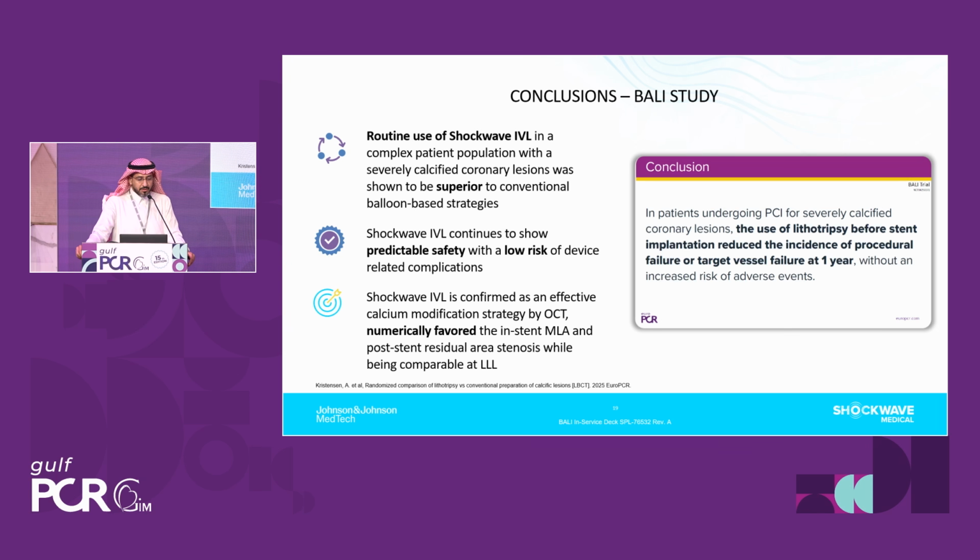So in conclusion, by this trial, we can declare a positive finding that the complex patient population with severe calcified coronary lesions was shown to be superior when you use the IVL compared to the conventional balloon-based strategy. IVL continued to be safe, and the Shockwave was confirmed to be effective. So it is superior, safe, and effective.